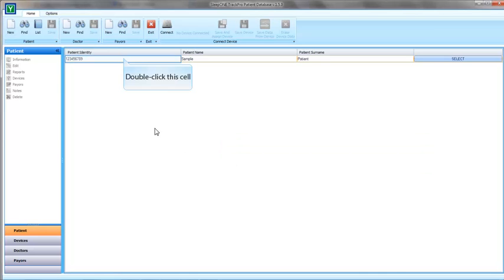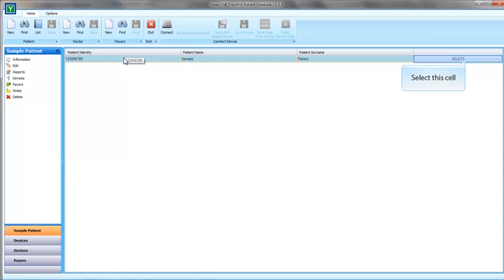First thing to do always is to select a patient record. Program functions will not work unless you select a patient. You can double-click a record to select it, or you can press Select button.